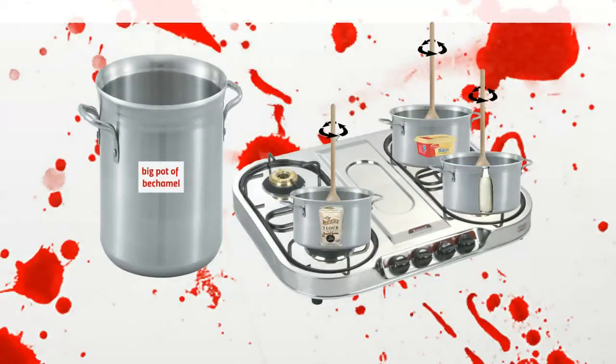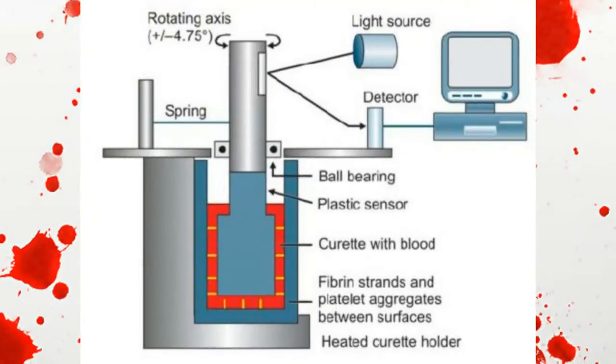And you mix them around and you find out the flour is what you're missing. So you add that to your big pot. That's essentially a 4-channel ROTEM. So each channel is a little bit like this. There's a pin and it spins in a cup of blood. And as the blood gets thicker, the torsion on the pin gets stronger.